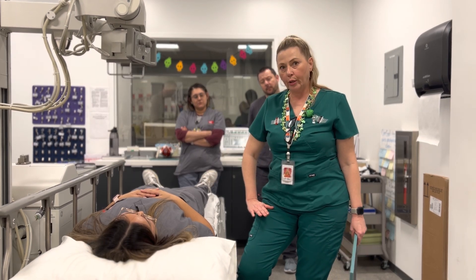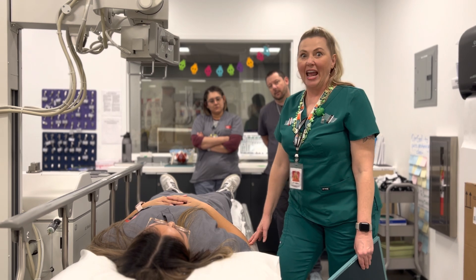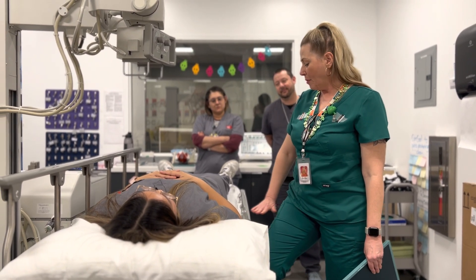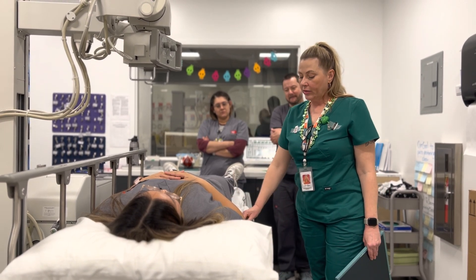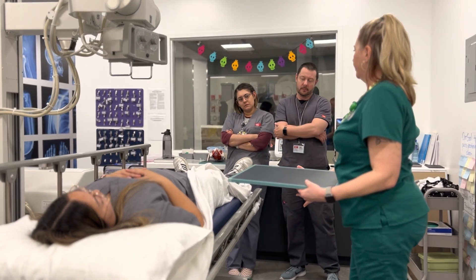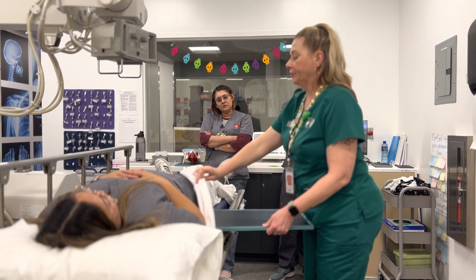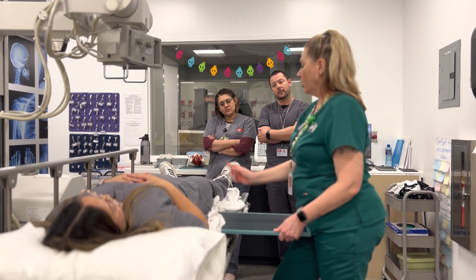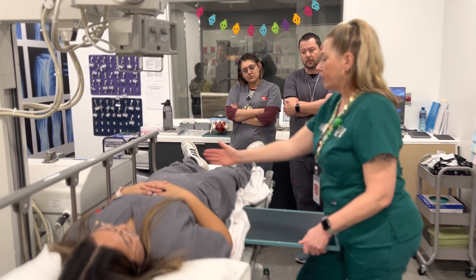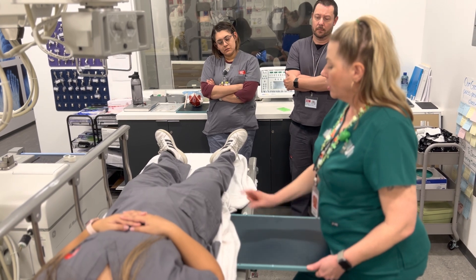It's where that crease is and a little bit below. When I pump up the bed, I tell my patient, 'I'm going to raise your bed a little bit.' Then I take out my sheets. I'm going to go crosswise. This does have a grid on top, so you won't see the black part — you'll see the white part of the grid, and it makes it a little bit thicker. I place the IR about where I think it needs to go before I even palpate my patient. The bottom part of the IR is about at the level of the pubic symphysis, a little bit below, and the top of the IR is going to be a little bit above the iliac crest.